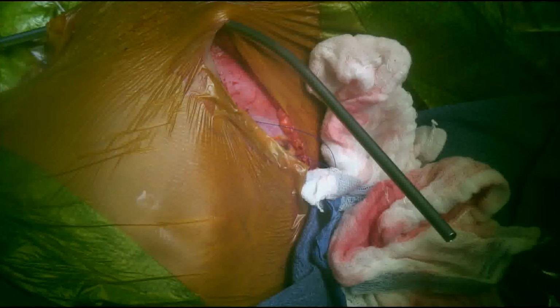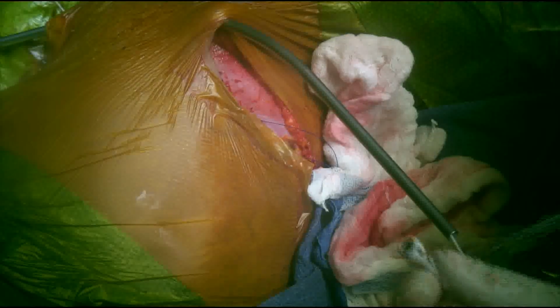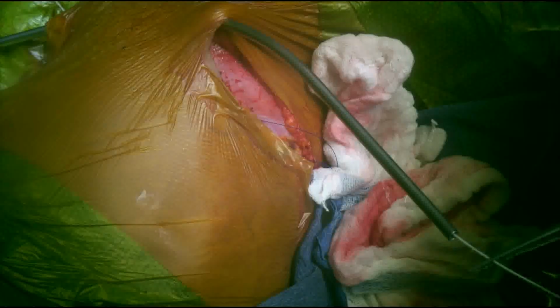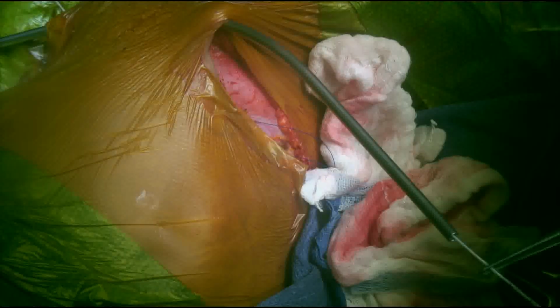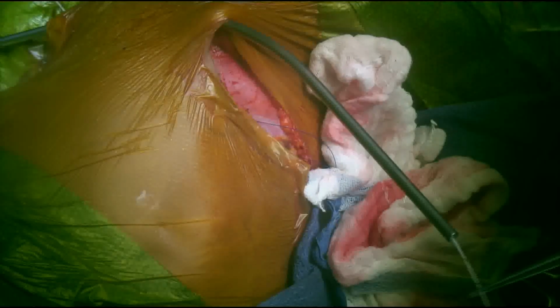A separate pump segment catheter is then inserted into this passer and passed through towards the spinal wound. Once this is delivered at the spinal side, the catheter passer can then be removed.